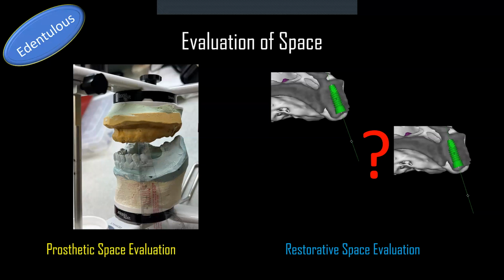But as you'll look at from the right half of the screen there, we have two different positions of that implant, and we don't know where the tooth is. So when we take a CBCT of the patient, we're just getting where their bone volume is. But when we're dealing with an edentulous patient, we have no representation of where the teeth are. And can't stress it enough, the patients are coming to us for their teeth. They want their teeth back, whether the denture is loose or they have terminal dentition. So we need to make sure that implant's emerging in the correct location, to deliver them the restoration in the correct location for that final restoration.